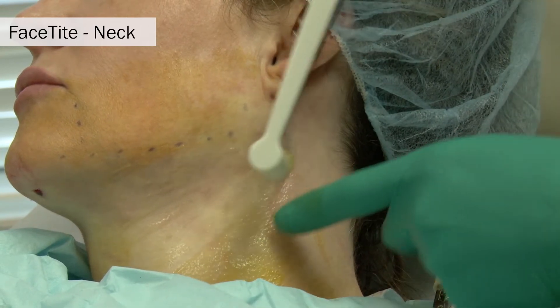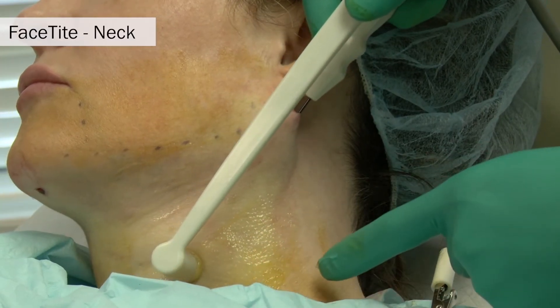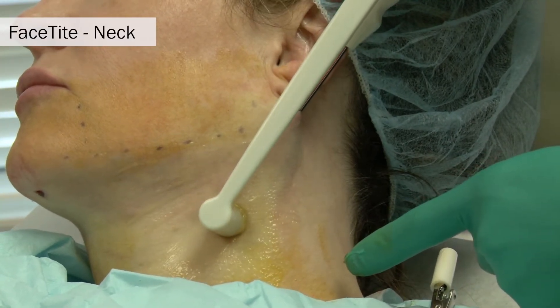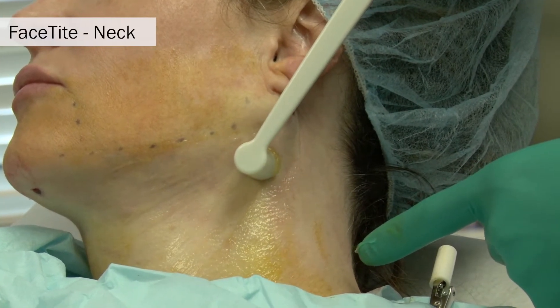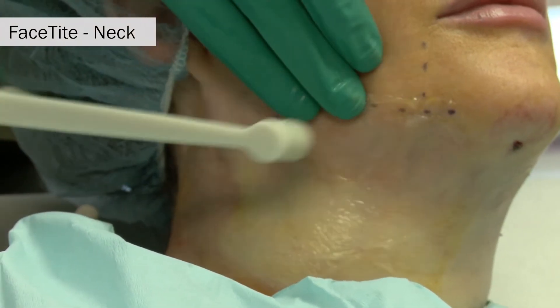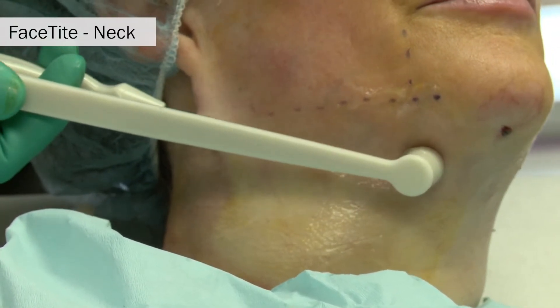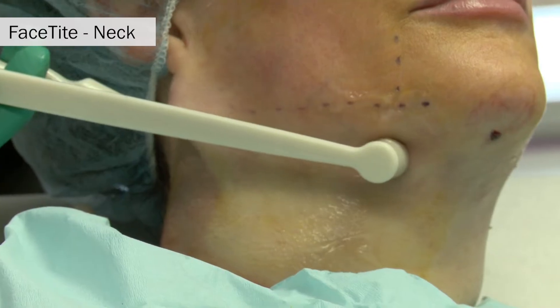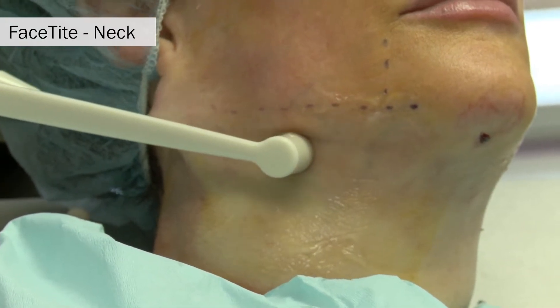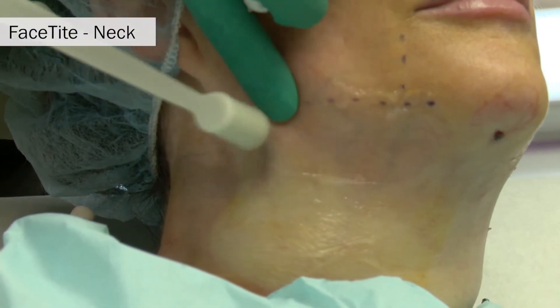One of the unique and important things to know about this device is that the energy is passed unidirectionally — simply from the deep electrode to the more superficial electrode. It is not being sprayed in all directions, only in that single direction. We are now treating the other side of the neck through the right lateral port or pilot hole.